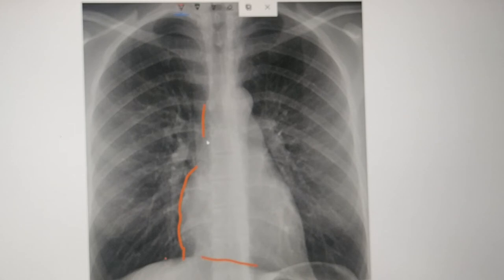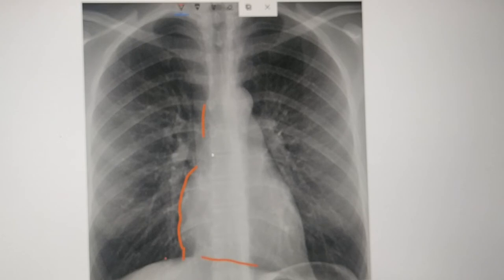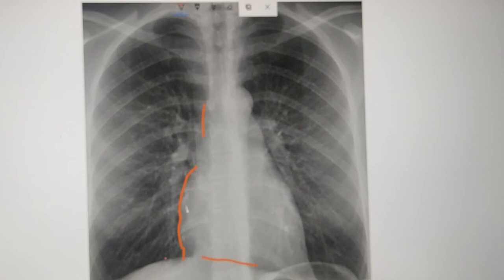Sometimes the right border of the heart may be formed by the ascending aorta if the ascending aorta itself is enlarged or dilated. Normally the ascending aorta does not take part in the formation of the right border, but if the aorta itself is dilated or enlarged, then it may take part in the formation of the right border. So normally the right border is formed by the superior vena cava, inferior vena cava, and right atrium.